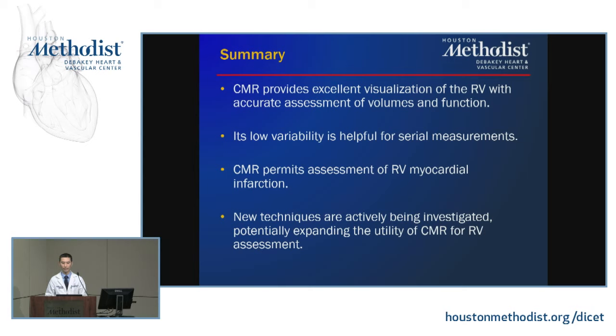So just to summarize, CMR does provide excellent visualization of the RV and accurate assessment of volumes and function. It has low variability and is helpful for serial measurements. It does permit the assessment of RV myocardial infarction, and new techniques are being actively pursued to try to improve what CMR can add to patients.